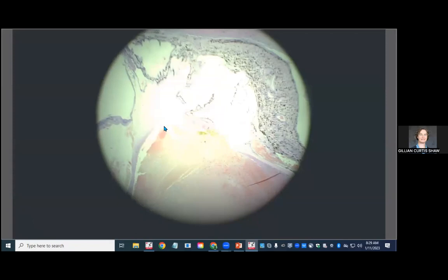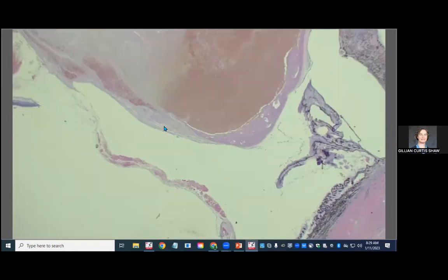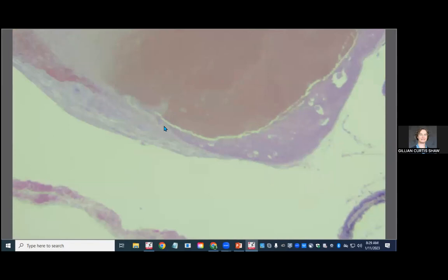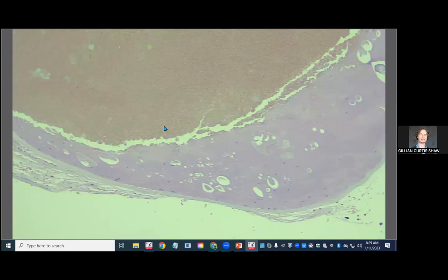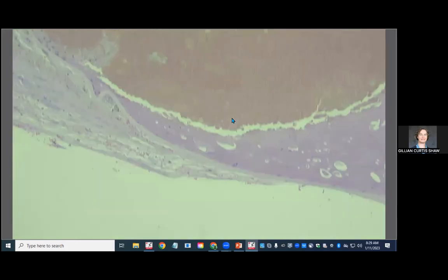So what I'd like to do is take you over to this side of the lens, and we'll follow the capsule on this side. So here we can make out some degenerate lens fibers. Here's the lens epithelium and the anterior lens, which is transitioning to the posterior. We've got posterior migration of that lens epithelium, which is part of the cataract. And we'll follow the posterior lens capsule here.